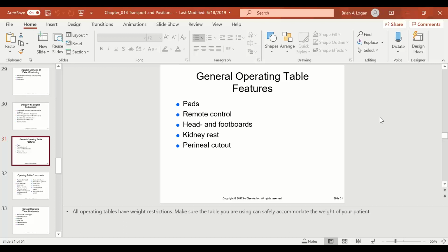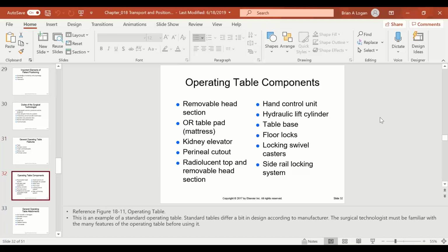It used to be that we'd have to put two beds side by side to distribute the weight, because I think early on the max weight was like 350 to 500 pounds per patient, but we know that we can have patients that get bigger than that, so they design bigger stuff now. You can take the head section off and move it down to the feet. That's what we do for lithotomy. That way the patient's feet don't hang off the end of the bed while we're putting them initially to sleep in supine.